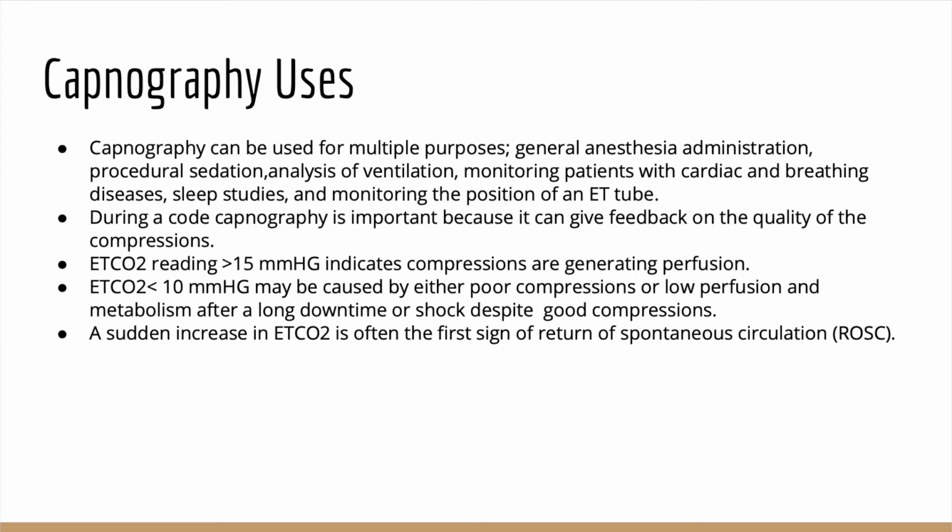So just to recap, consistent high-quality compressions are essential for cardiac arrest resuscitation. A higher end-tidal CO2 during resuscitation correlates with improved cardiac output and the patient's outcomes. When ROSC is suspected in a patient, compressions need to be stopped and pulses need to be reevaluated.